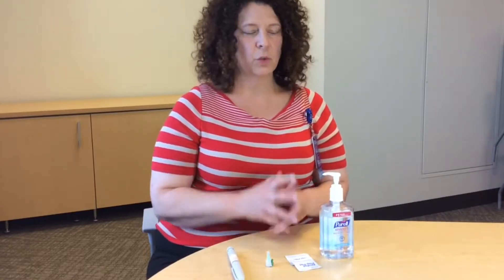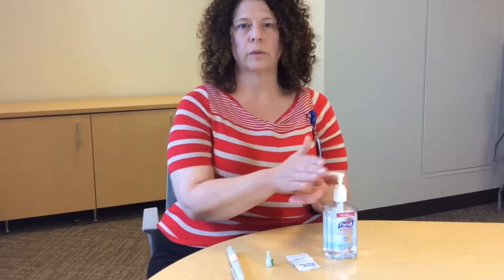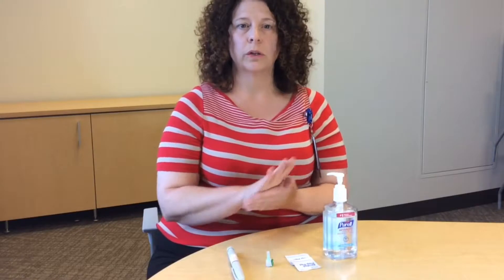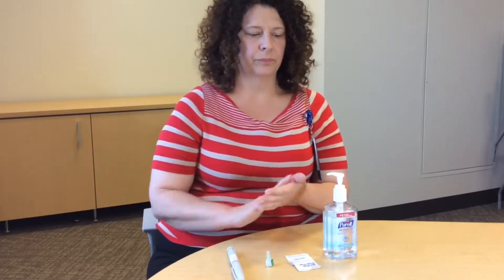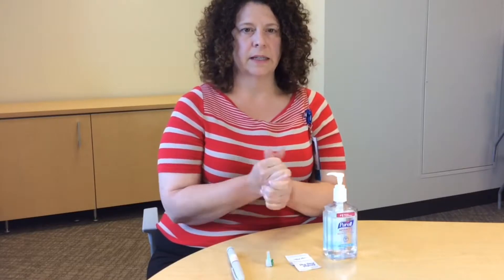So now we're going to actually inject the insulin. First, you want to wash your hands with warm soap and water before each injection, or you can use a hand sanitizer like I'm doing now. Get your hands nice and clean.